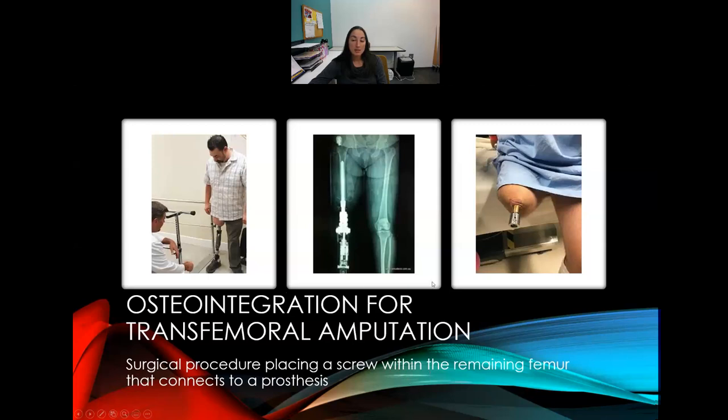But the other thing is sometimes it's hard to heal the very bottom portion right around the metal portion because there's a foreign object right there. So it's really hard for the skin to fully heal. A lot of times they weep around the area and they get infected and stuff. So you have to be really careful about that. But the convenience of it, of being able to just snap the prosthetic device in and not have to worry about proper fit of the garments in between and all that type of stuff, may be more beneficial for some people.